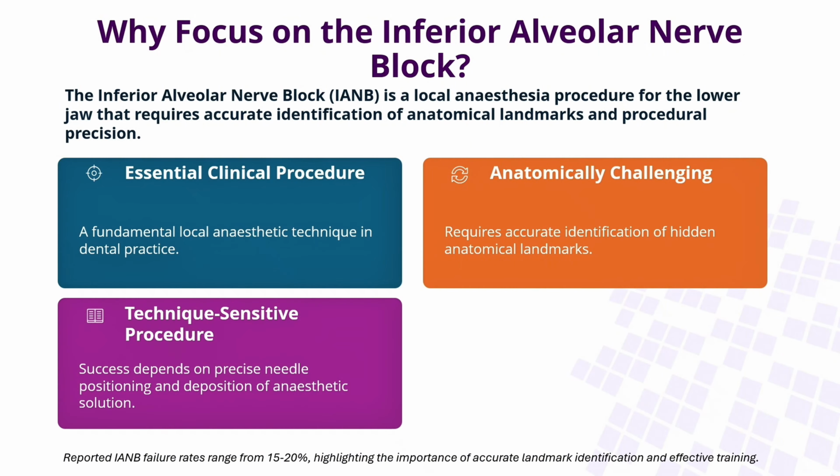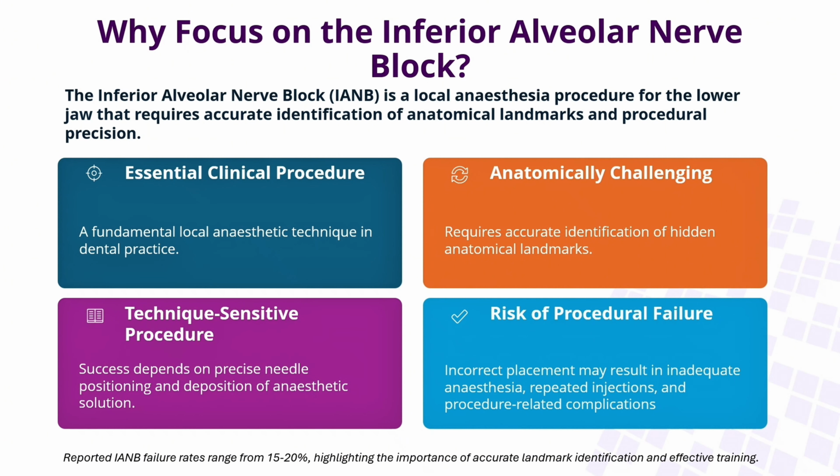Students therefore rely on anatomical landmarks to guide needle placement, and accurate contact with the bone is an important indicator for correct positioning. If these landmarks are identified incorrectly, the injection may fail, resulting in repeated injection, inadequate anesthesia, and potential complications. So how do we currently prepare students to perform this challenging procedure?